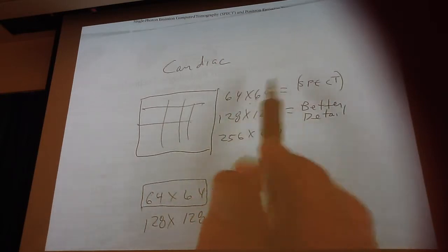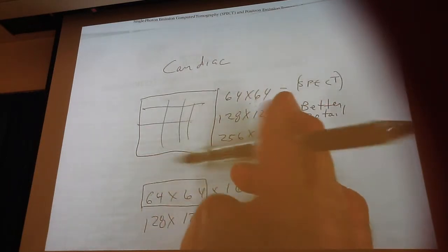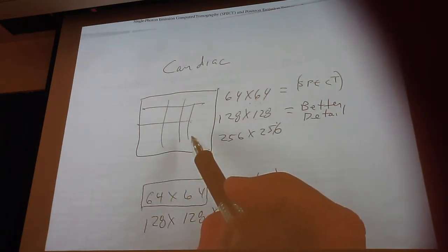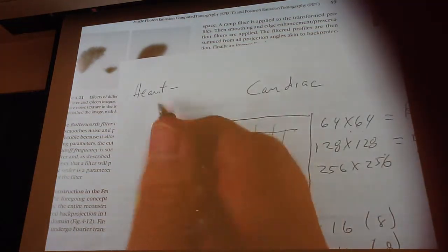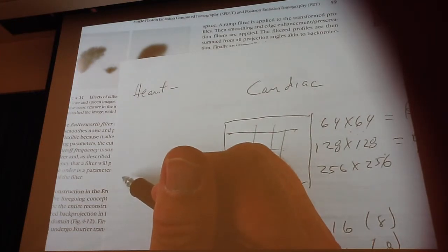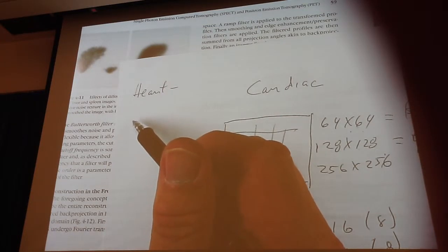Could you go over and take an imaging center and you're the chief tech now because everybody quit and you're the boss, and the doctor says, hey, these images look a little bit funny to me, can you help me out here? And all you do is you see, oh, here's a heart. Okay, well, you got a heart thing. You push that button and it's going to process whatever you did. You did a rest, you did the stress first and then you did a rest. Or you did rest first and then you did a stress.